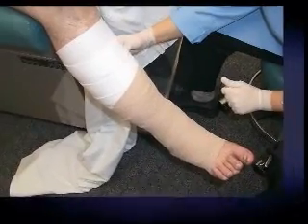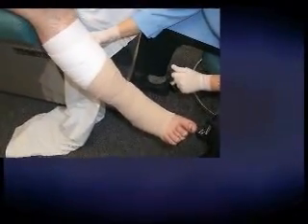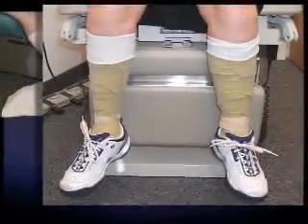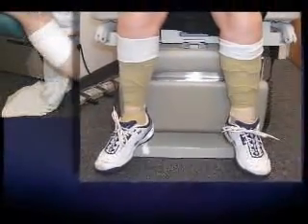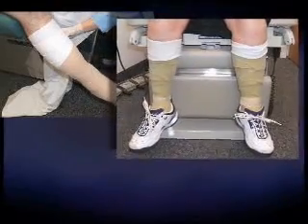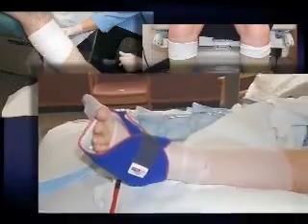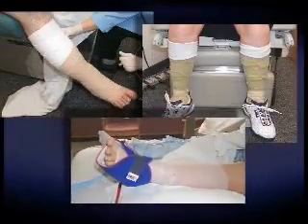A variety of devices are available to treat leg disorders related to venous disease. Using a method in a particular patient that is associated with the greatest compliance is the key to successful management. No one device is suitable for everyone. The approach to each patient must be tailored to a variety of pathologic, social, economic, and personal variables.